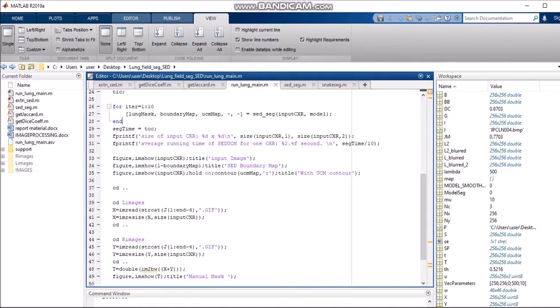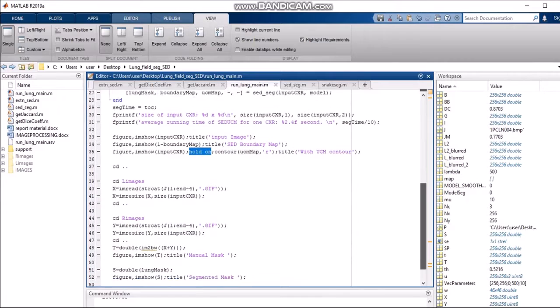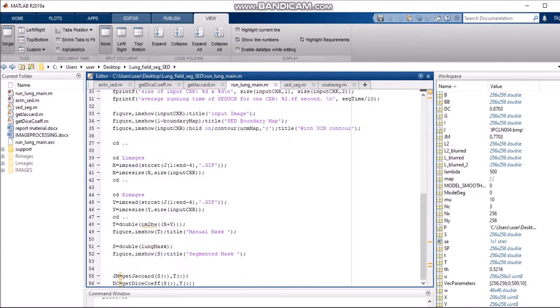The average running time will be printed by the fprintf method. We are dividing the segment time by 10 because we are iterating it over 10 times, and we are also displaying the size of the input. We then show our input image in a figure using the 'imshow' function. Next, we show the SED boundary map, and then the input CXR using 'hold on' to retain the current plot. We apply contouring using the UCM map, where 'r' applies red regions.